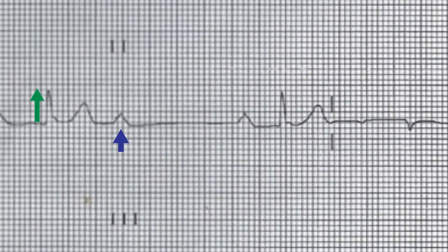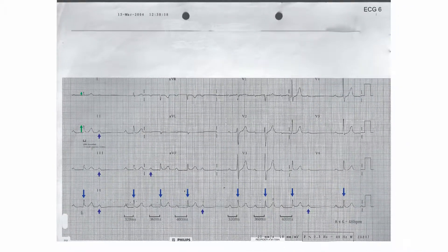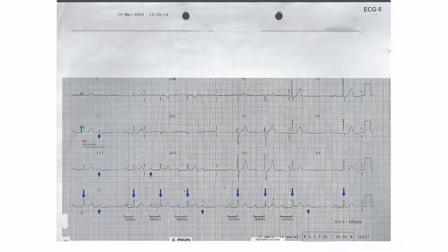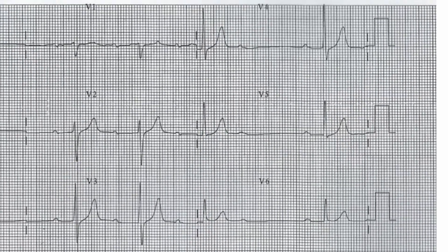The QRS complexes show no pathological Q waves and are less than 3 small squares in duration. The ST segments are flat, the T waves are upright throughout, but are somewhat peaked in the anterior leads.